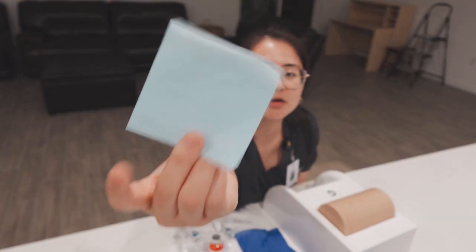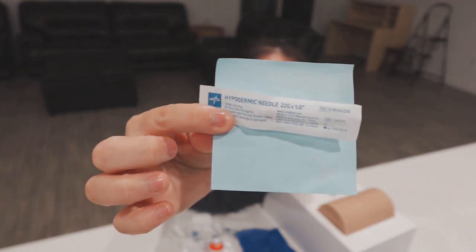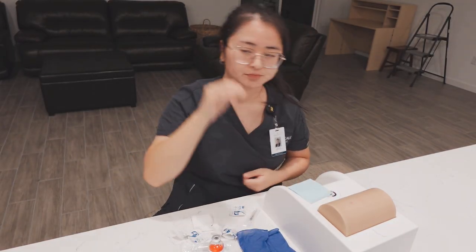This post-it doesn't have anything on it. I'm not reading from it. I'm just showing you that there's nothing on it. I have it because I want to show you my supplies or my syringe later on. This helps to focus on the syringe.